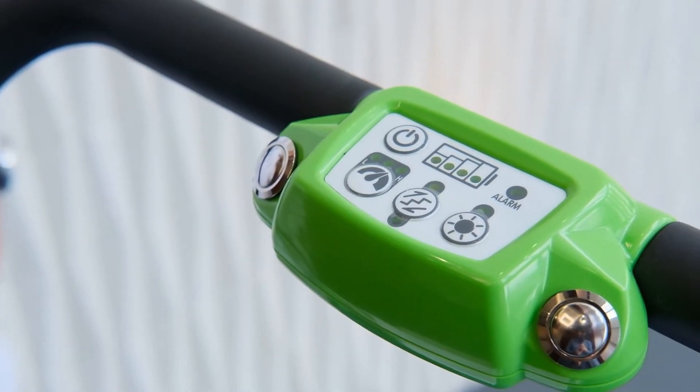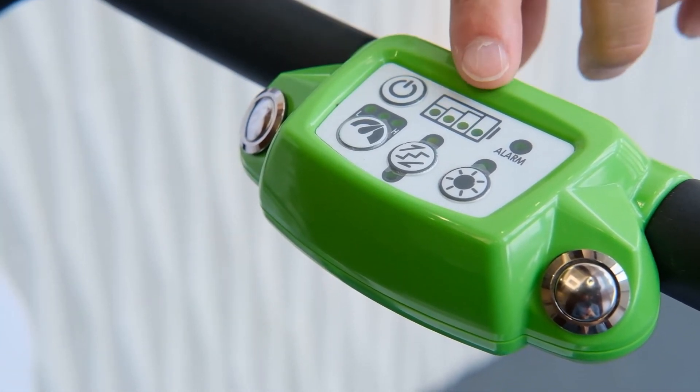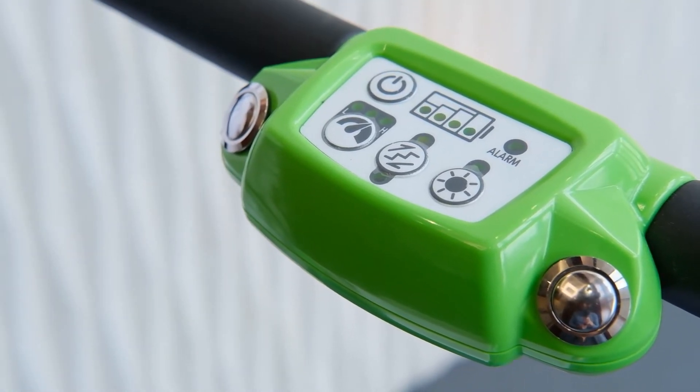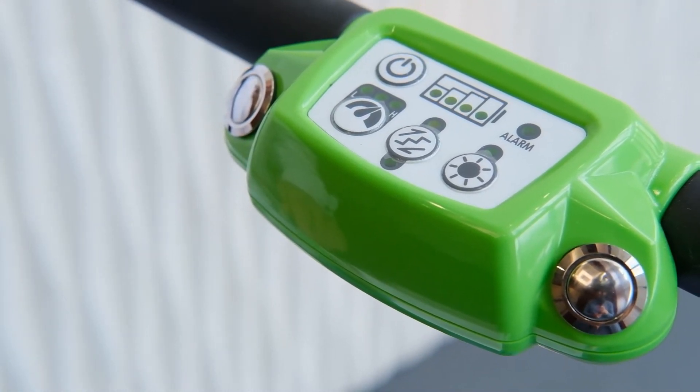The control panel at the top of the chair has seven functions. This is the power button — use this to turn the chair on and off. This is the battery power indicator: red means low battery and green means a full charge. This is the alarm; if this light is flashing, please refer to the alarm codes in your instruction manual before operating.